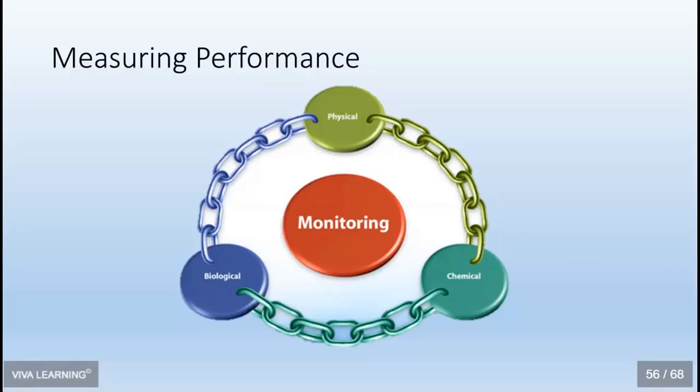It doesn't say anything about the pressure or the time. Now, if you're moving into something that's a multi-parameter indicator, then that one would have to measure at least 2 out of the 3 variables of steam sterilization. But the gold standard, what we count on to prove lethality, is biological monitoring. And that's when we're doing our weekly spore tests.